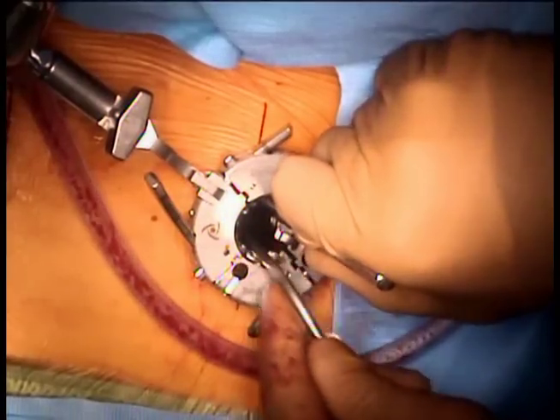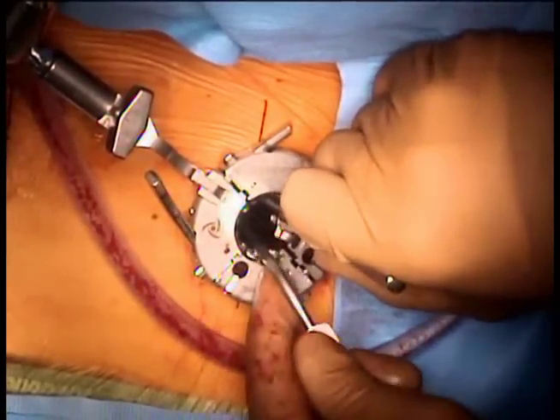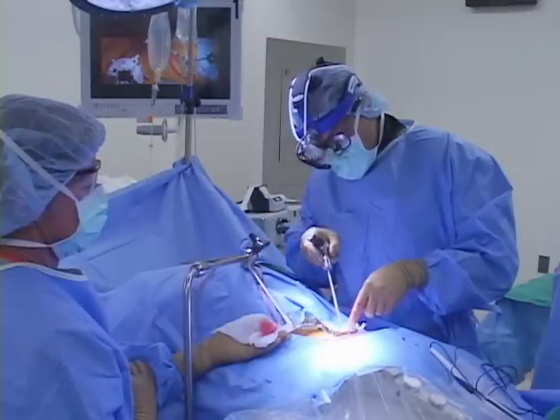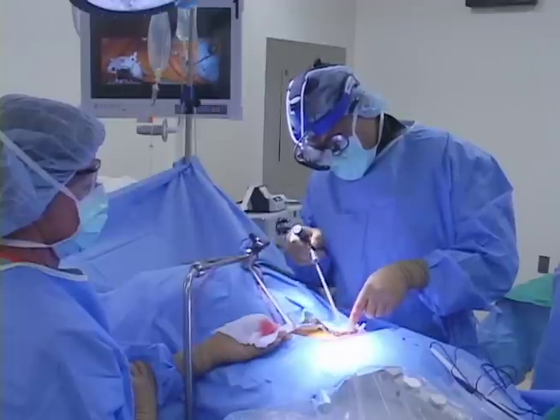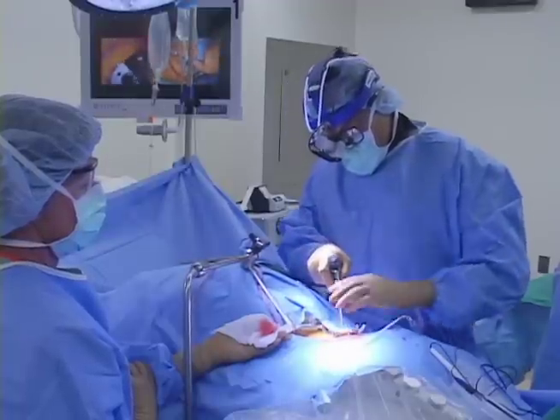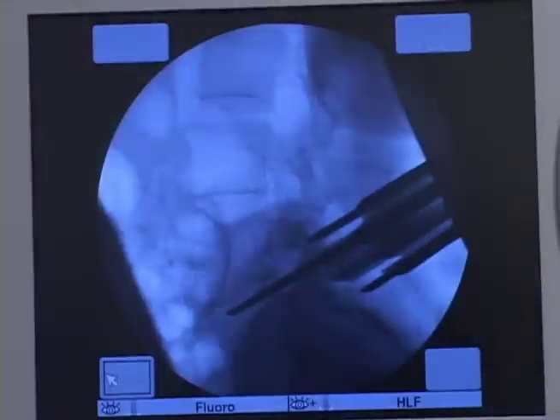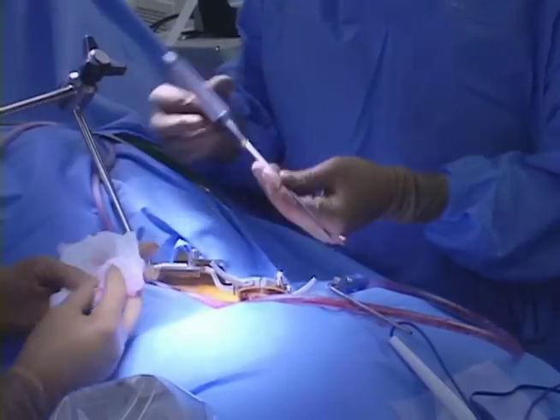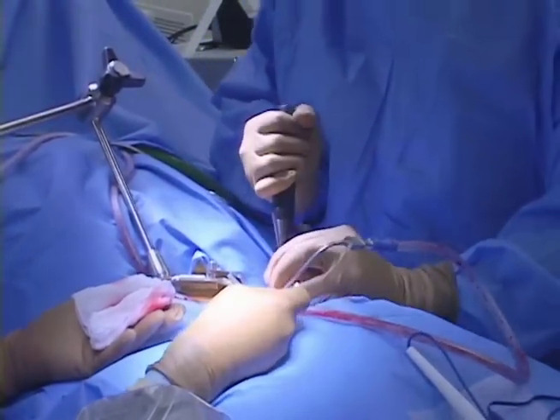Here's the Penfield. We can see the disc space in view right here. We will start to engage into the disc space. We have a series of disc space curettes that will remove the disc. I take an offset curette and I'm going to reach further across the disc space.